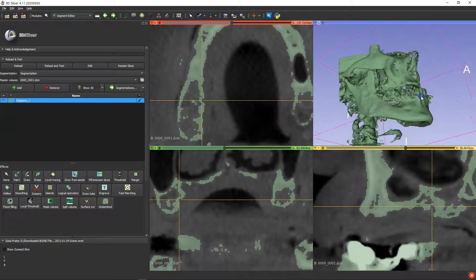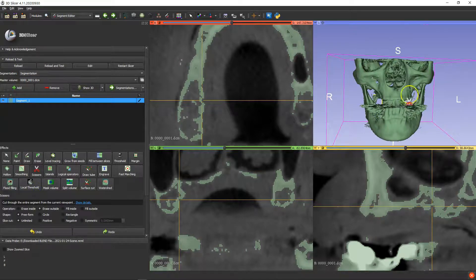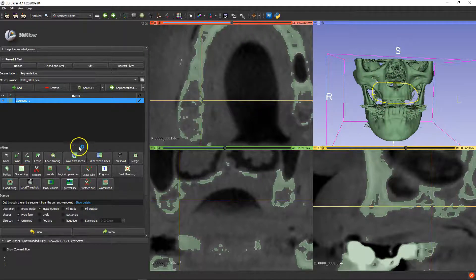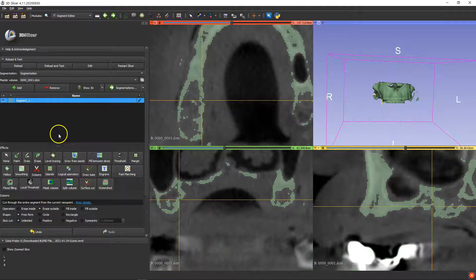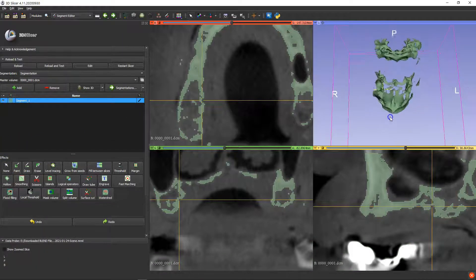Alright, that's looking a bit better. Scissors and erase what's on the outside. Remember always to click on none before you move it.